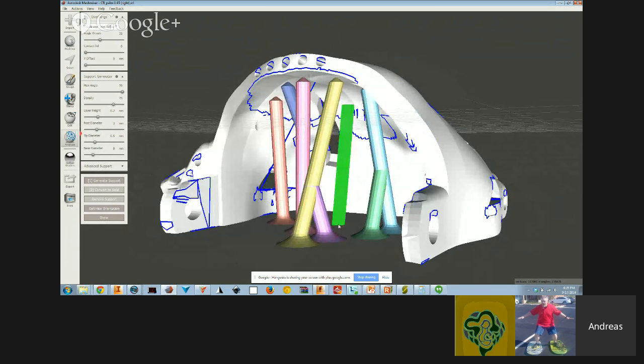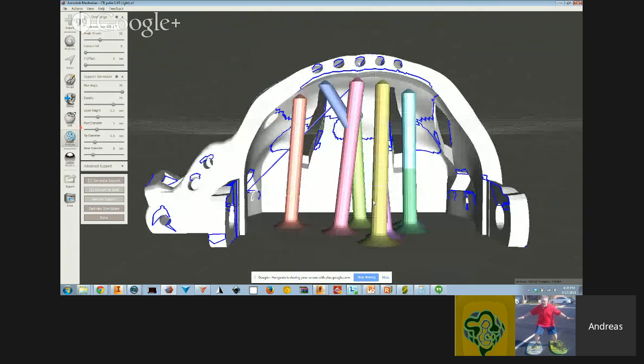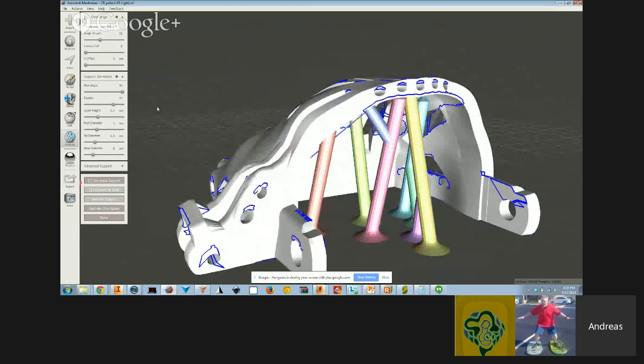If you click and drag and it doesn't add it, it's because it would self-intersect. You can just drag it out here. It might give you more problems. If you want to override it, you can. When I click and drag and it doesn't add it, I can override it by just pressing Shift, and then it'll add it. For whatever reason, it didn't want to add it, usually because it thinks it's intersecting itself or something like that. So that's just good stuff to know.